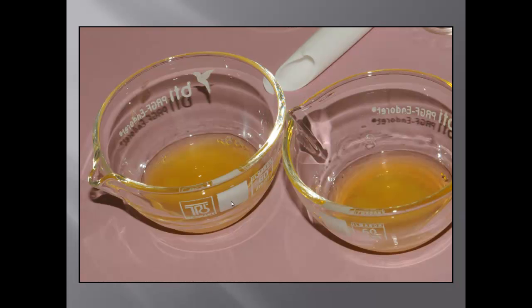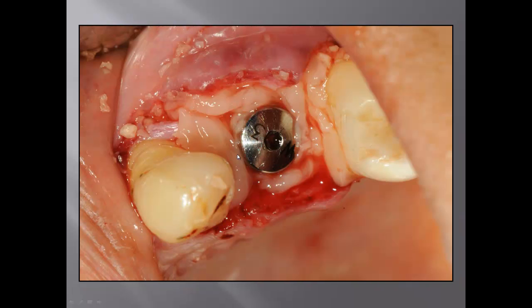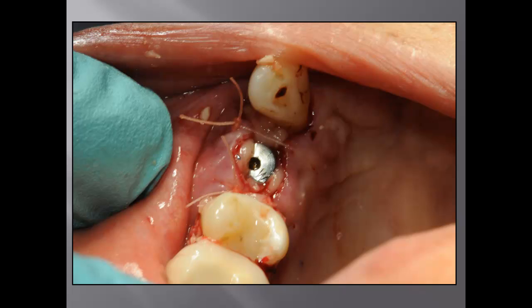In this case we use two membranes for this type of surgery. You can see the envelope incision, the bone graft placed, and the membrane positioned — it's shown on the next slide. This is the final picture. I hope you found this presentation helpful, and thank you very much.